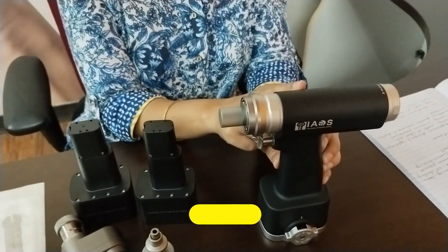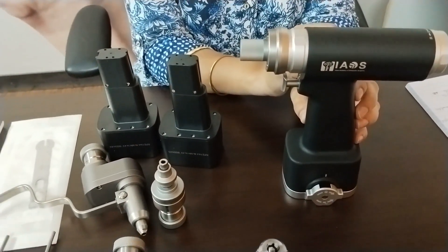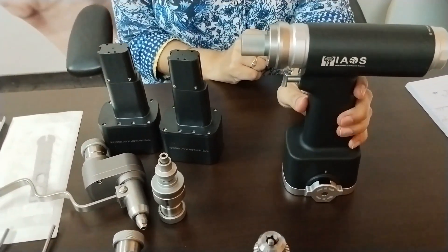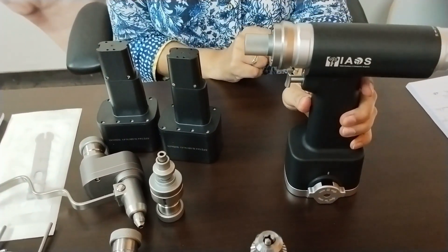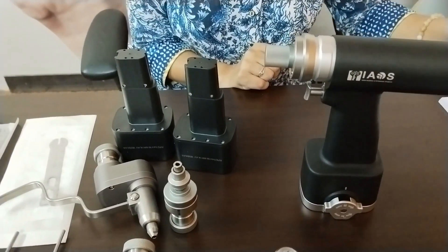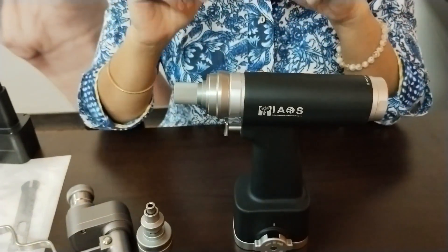The handpiece has an ergonomic design with lightweight construction and is ideal for minimally invasive procedures, enabling greater precision and smaller incisions. It weighs up to 1 kg and is fully autoclavable up to 135 degrees centigrade. The features of the handpiece include a chuck cover.